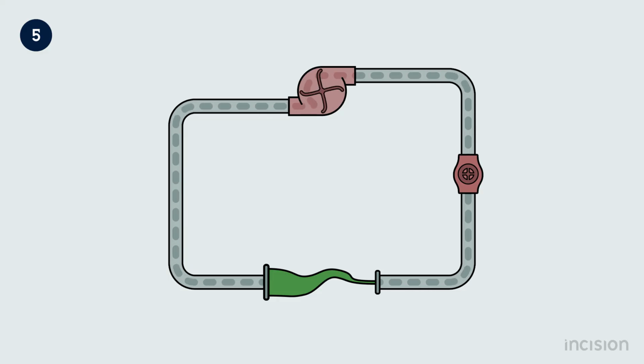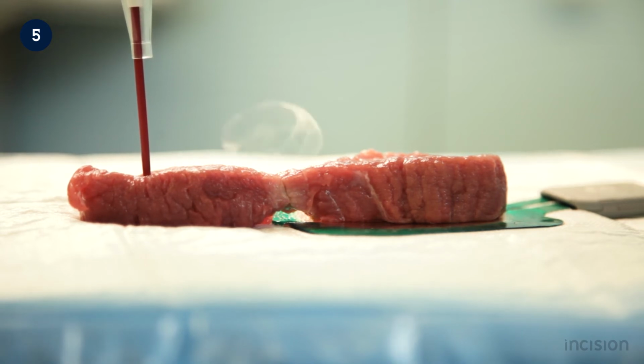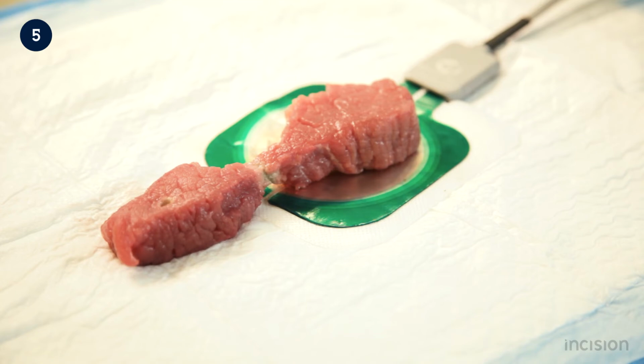This can also be compared to a long tube that starts very narrow, but quickly becomes very wide. Water will flow very fast in the narrow area, but rapidly slow down as the tube becomes wider. Monopolar electrosurgery should only be used when the electrical pathway to the dispersive plate does not contain another point where a large current density may occur, as this will result in similar heating at this second high current density point.